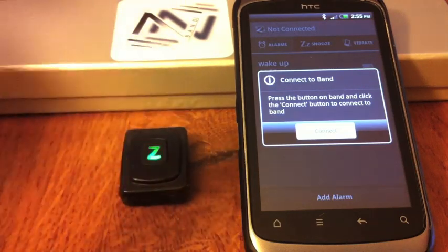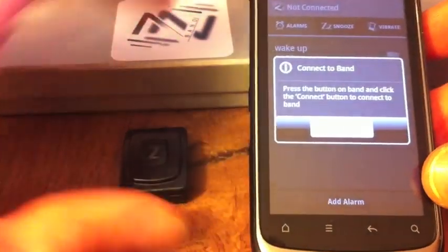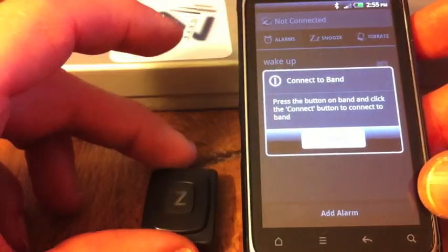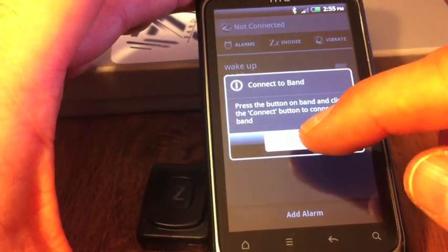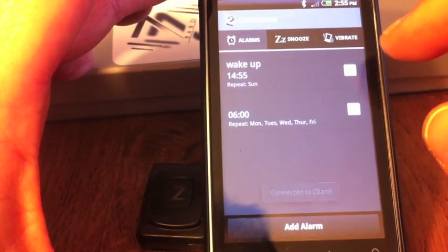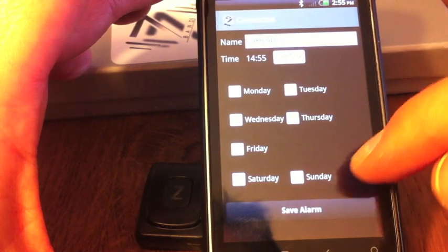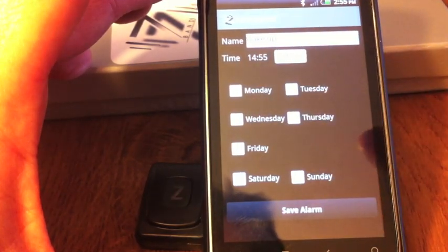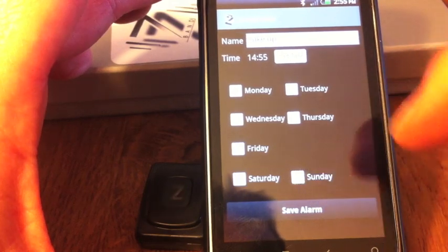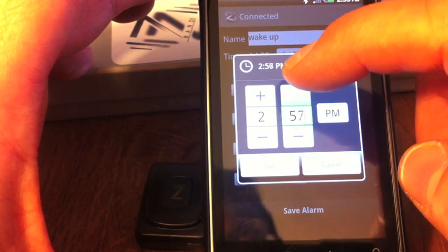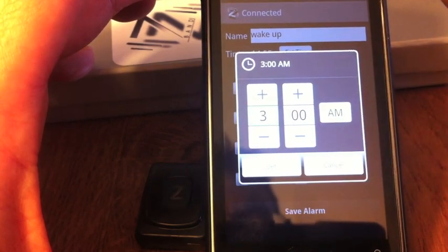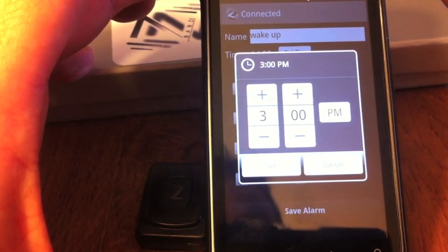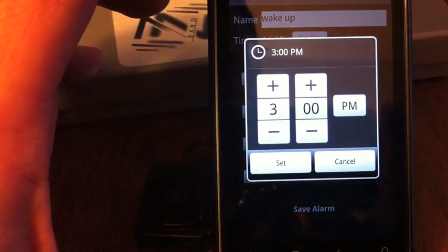That will start to flash. You've now got 90 seconds to put all the information on that you want to. So I've put the Z-Band thing there, and we shall go to connect. So that's confirmed. Now, it doesn't come up very well on this camera, but I have actually got two alarms. You can check Monday through to Sunday if you want an alarm to go off at a particular time every single day. At the moment, we're just going to do Sunday. I'm going to press set alarm, and I'm going to do it for 3 p.m. Okay, 3 p.m. Don't forget the p.m. I've done that before.